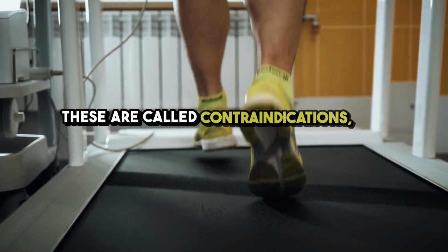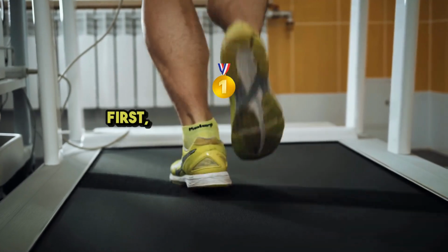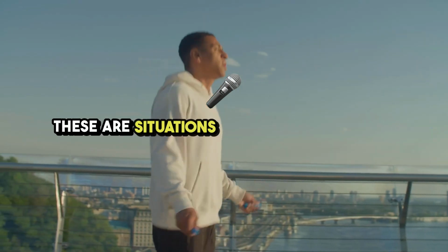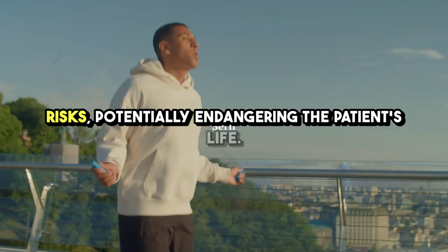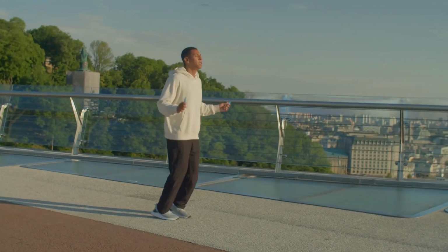These are called contraindications, and they are crucial to understanding for patient safety. First, let's discuss absolute contraindications. These are situations where performing an exercise stress test could pose significant risks, potentially endangering the patient's life. If any of these conditions are present, the test should not be performed.